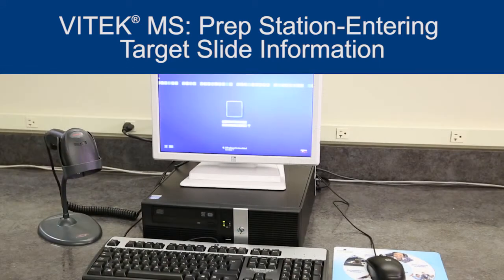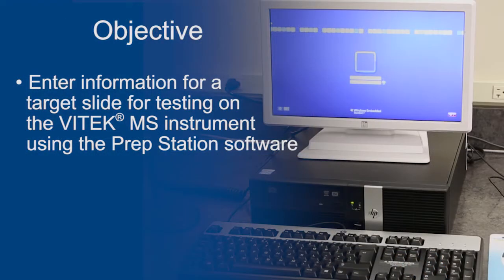Depending on your laboratory workflow, information can be entered before sample preparation, concurrently with sample preparation, or after sample preparation. At the end of this video, you should be able to enter information for a target slide for testing on the Vitec MS instrument using the PrepStation software.